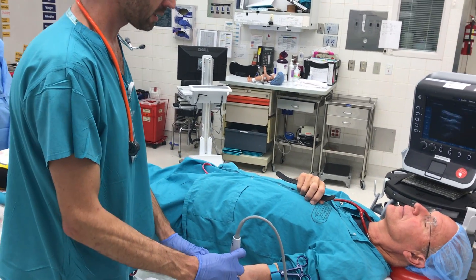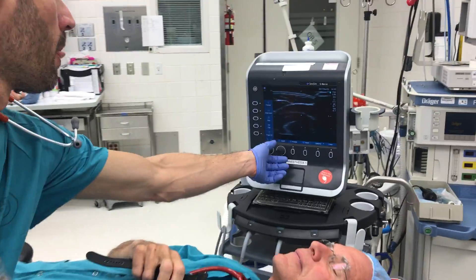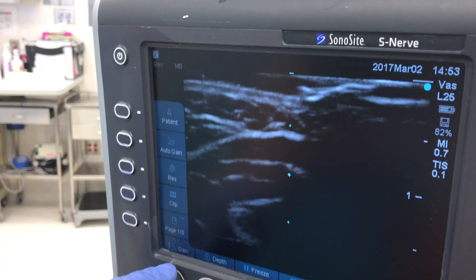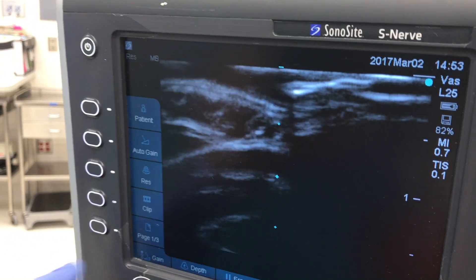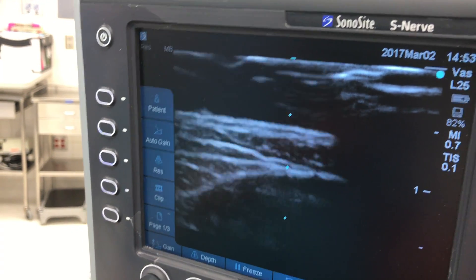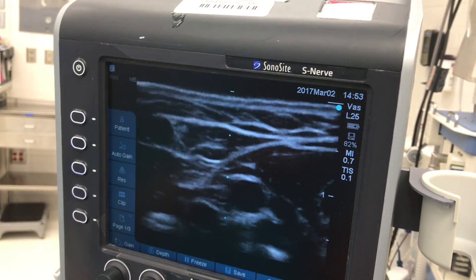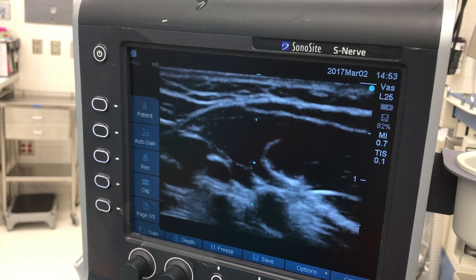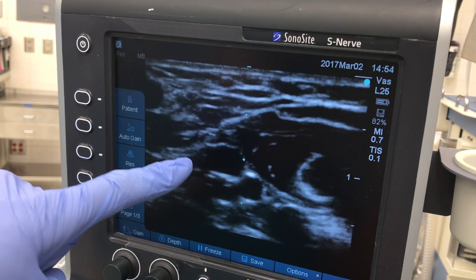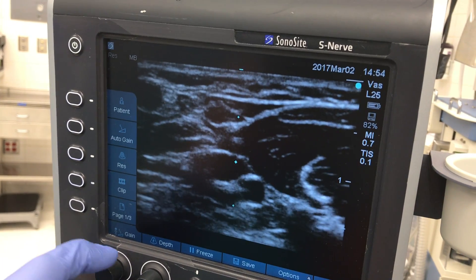Let's see if we've got a good vessel here before I start. Starting out of plane, with the depth at the minimum. I'm going up a little bit. I'm just scanning to look through a vein. And as we can see, we have some huge vessels in the centre here.